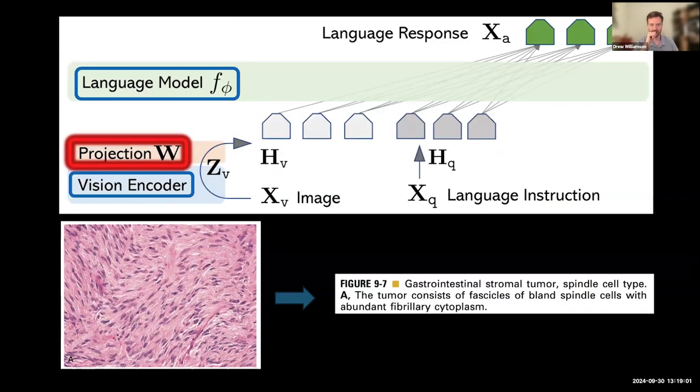All right. Next up, our training of this model proceeded in 2 steps. In our first one, we're just going to train that multimodal projector that goes from our image embedding space to the large language model's embedding space. Here, we give an image and we give the matched text, and we ask that these 2 things end up at the same point in the language model's embedding space.